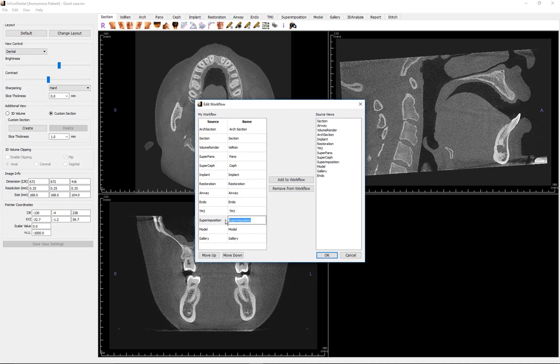A view tab may be removed from or added to the toolbar. Let's remove the superimposition tab. To lock in our changes, the software must be closed.